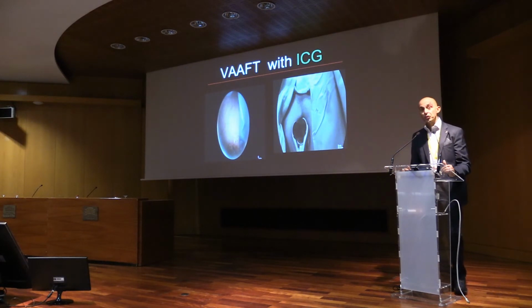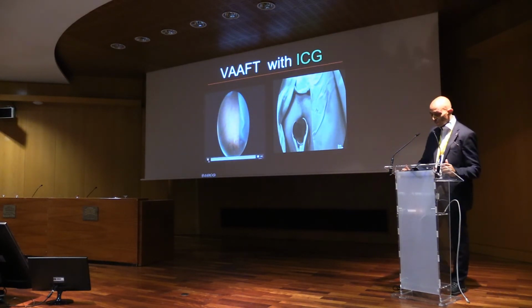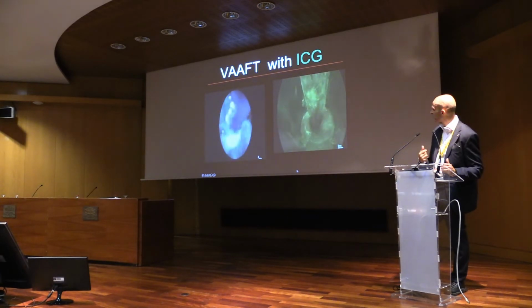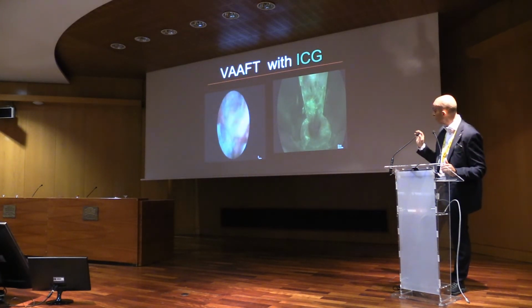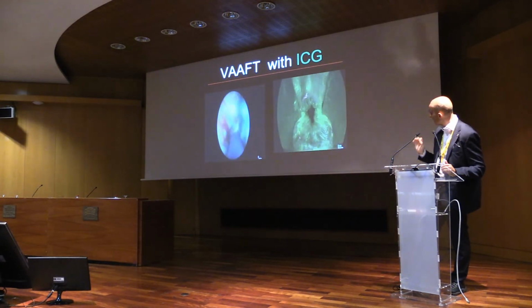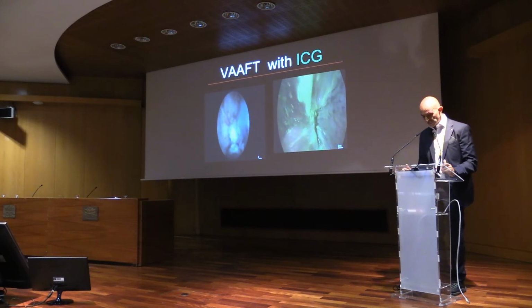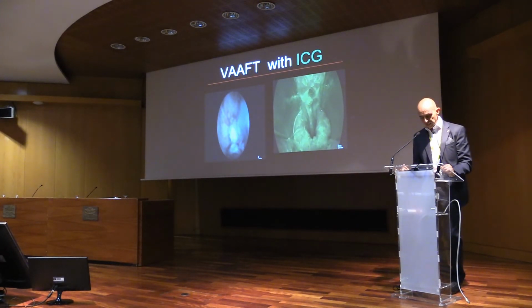And also for the treatment of anal fistulas, we treat it using endoscopic technique, but to identify the anal part of the fistula, you can inject the green in the fistula, and you enter the anus with an anoscope, and you can identify where the fistula is to treat the anal orifice. Next.